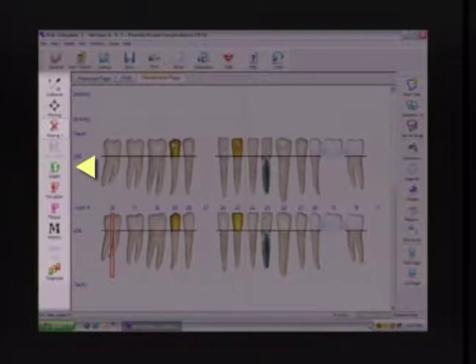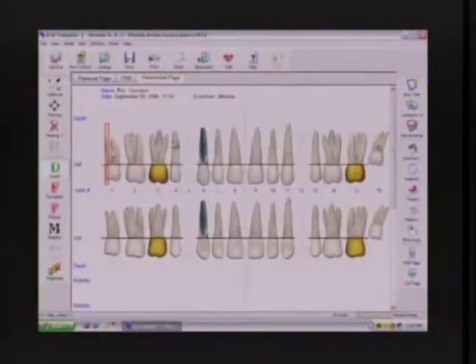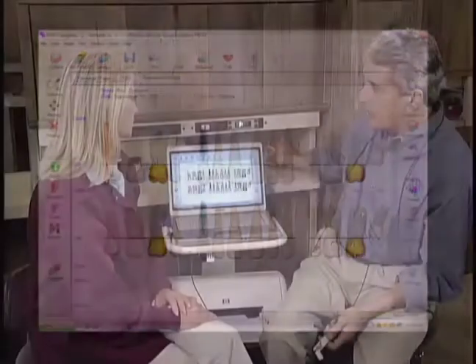So if I'm confident, I advance. Upper arch, entering pocket depth. It moved into pocket depth, and I'm ready to begin the exam. Now, the cursor is on the distal buccal of 1. So I'm ready to begin with the patient.